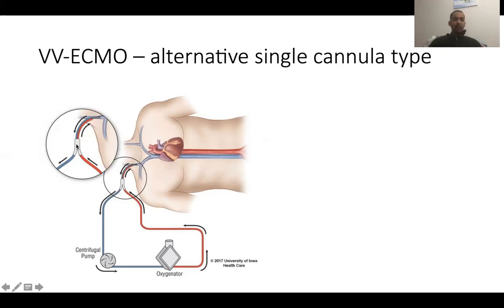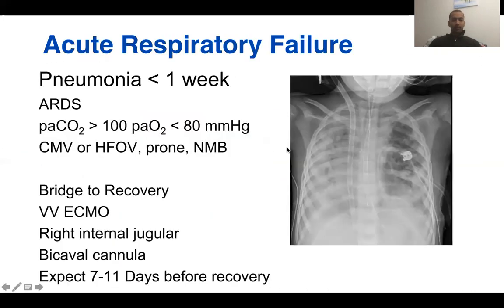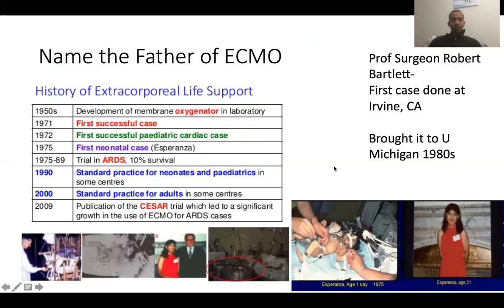so right here, what happens is the single cannula has two ports within it. Okay, and there is one port. It all depends on the placement of the cannula tip. And as I see here, let me show you here a couple slides back.